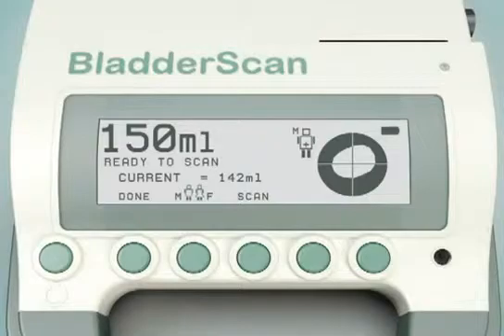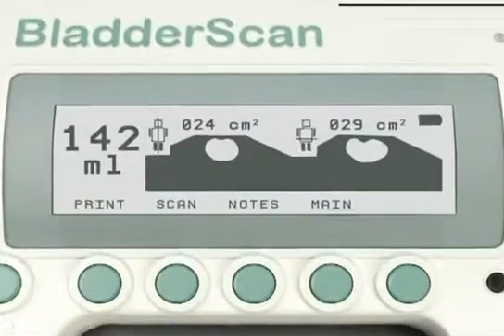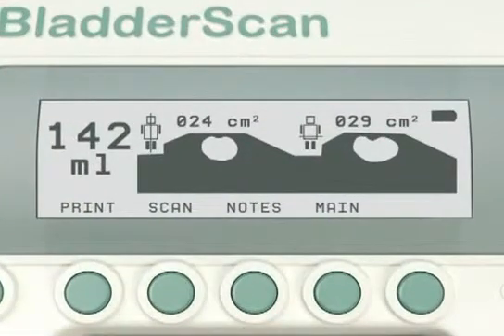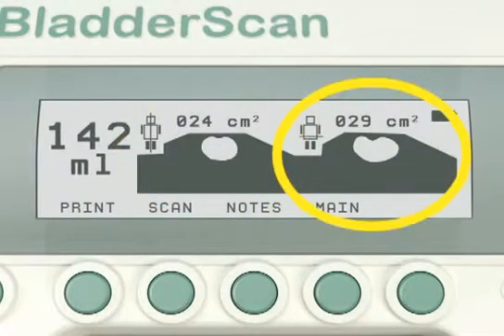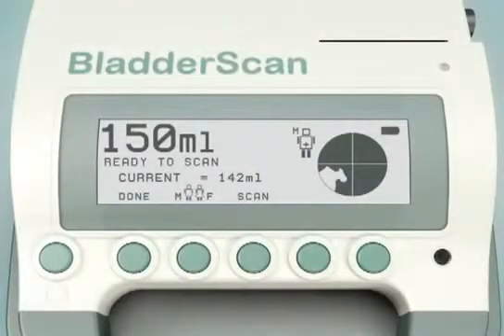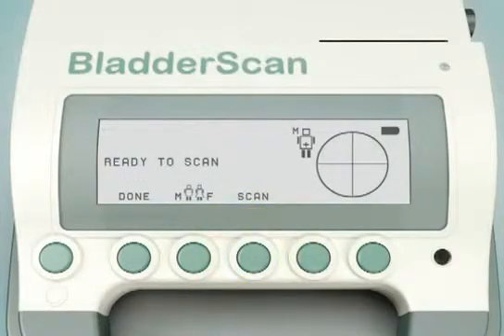When the scan is accurate, press the Done button to view the Scan Results screen. Verify that the bladder image was completely contained in both the vertical and horizontal scan planes. If the bladder image overlaps the edge of the scan planes or appears to be cut off, press the Scan button to return to the scanning screen and re-scan the patient.